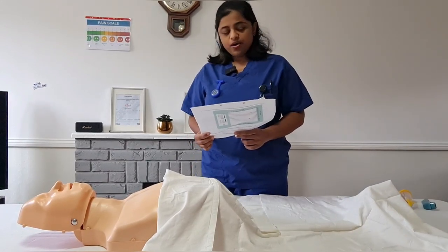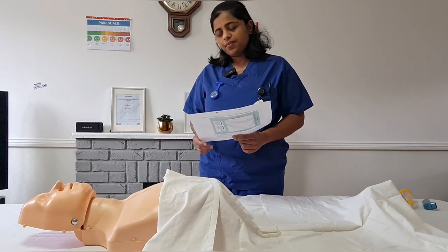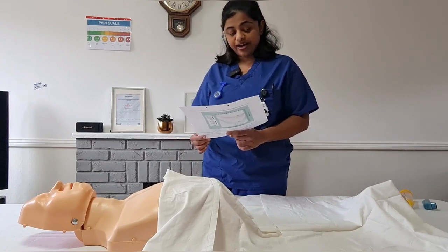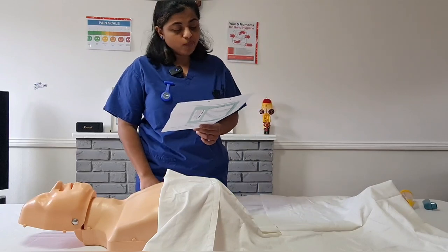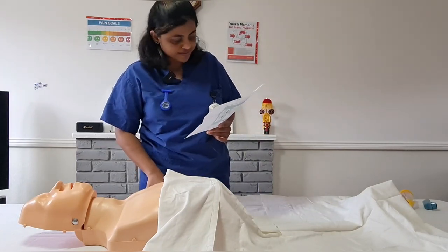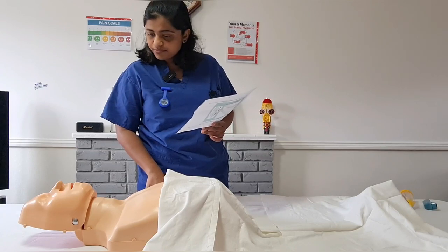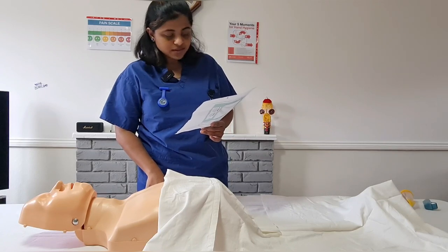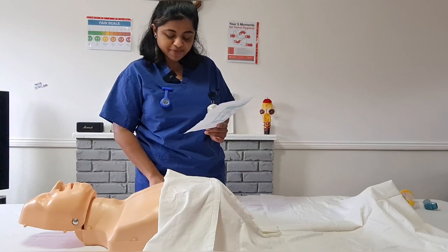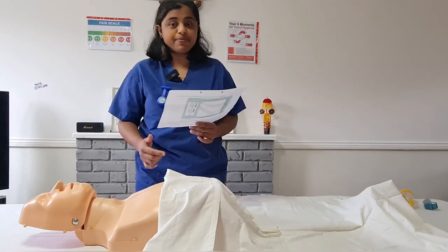Because it is a medication, I need to check your details once more. Can I check your full name please? Miss Emma Hargraves. And your date of birth please? 26/9/1963. And your hospital number is 12345. That is the right patient.